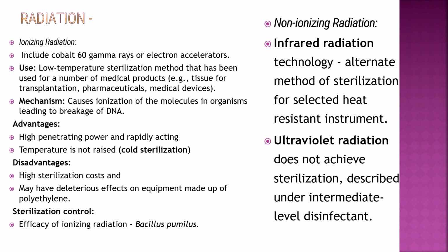Non-ionizing radiation: infrared radiation technology is an alternate method of sterilization for selected heat resistant instruments. Ultraviolet radiation does not achieve sterilization; it is described under intermediate level disinfectant.